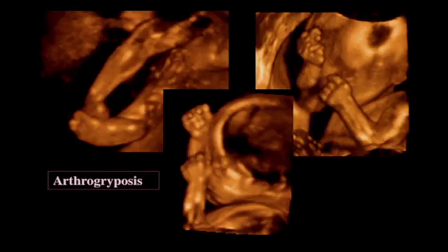Now, this fetus and the next one have arthrogryposis, and you can see by these images that the arms and legs are really fixed.